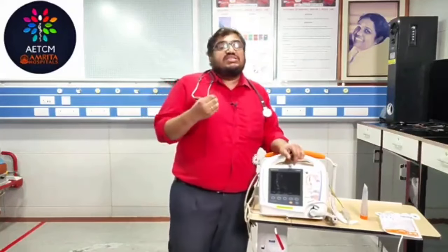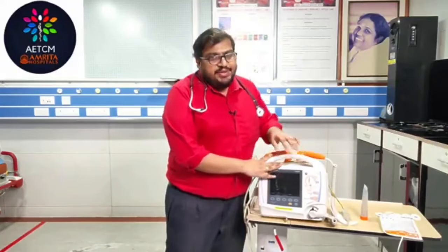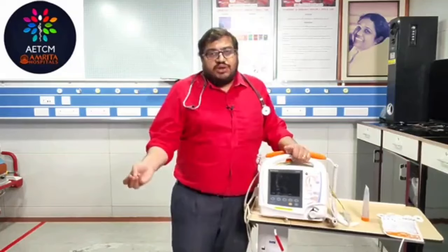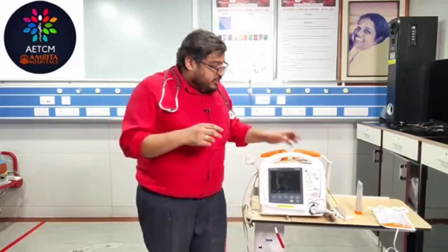So what are the things that are needed before you decide to defibrillate? It is mandatory to have a defibrillator. Yes, you need to have a biphasic or a monophasic defibrillator. There are a lot of brands of defibrillator available. Make sure that it is adhering to the protocols and it is approved by the government of India or whichever regulatory bodies your country has. That is one most important thing, because there are a lot of substandard defibrillators available. Sometimes the shock will not be delivered, or it might be harmful to the doctor who is going to deliver the shock. So first of all, you need a defibrillator.